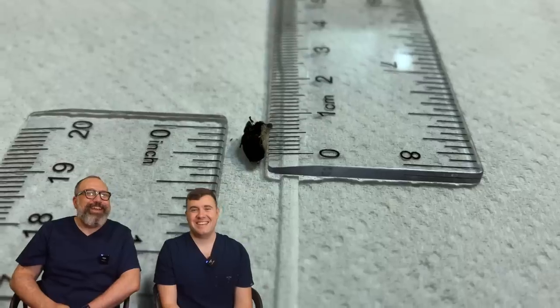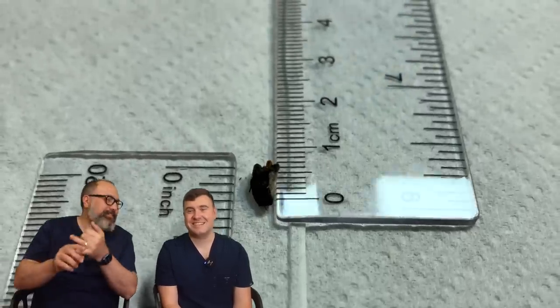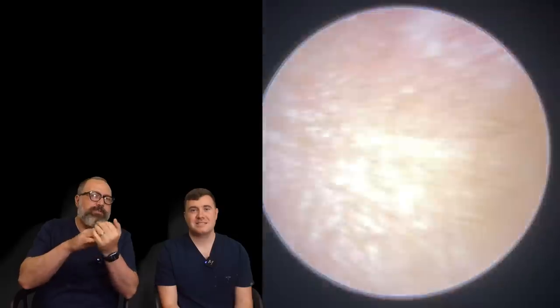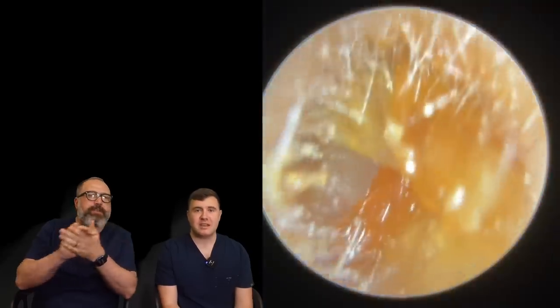We say this all the time, but the tip of the little finger — when it's down that deep and it's right on top of the eardrum, it's going to cause some problems. A couple of little spots there, but we'll just advise this patient to continue using some olive oil just to clear those last tiny little spots away.